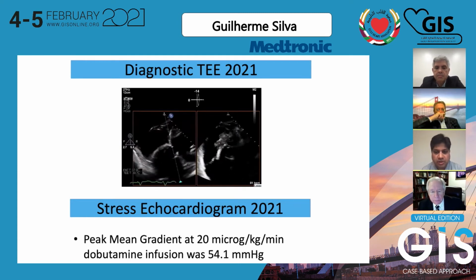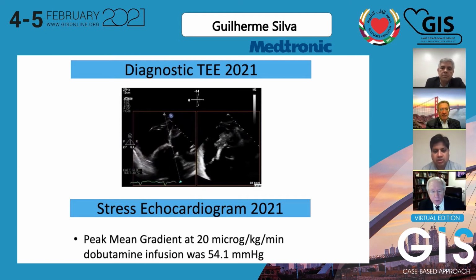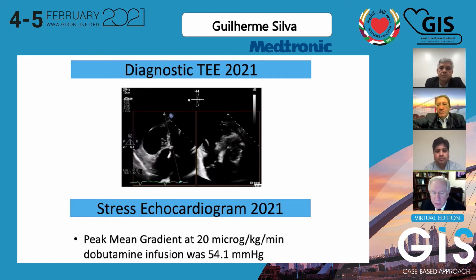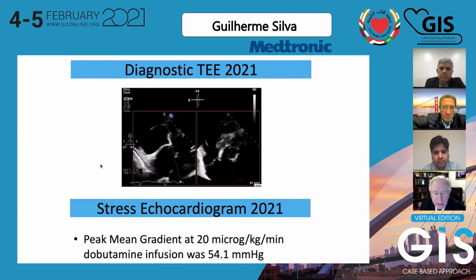Dr. Kosali can further say, he would have done thousands of these cases with expanding the roots and other things. What do you think, Dr. Kosali? Well, I think as an 89-year-old with previous lung resection and COPD in the rest of the lung, an open operation would be exceedingly difficult, if not impossible, for this patient to recover from.